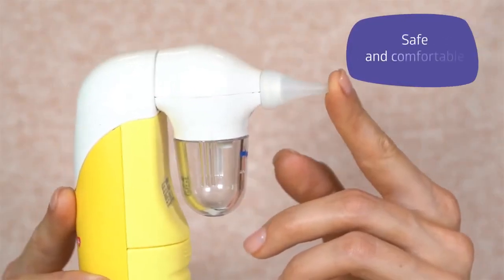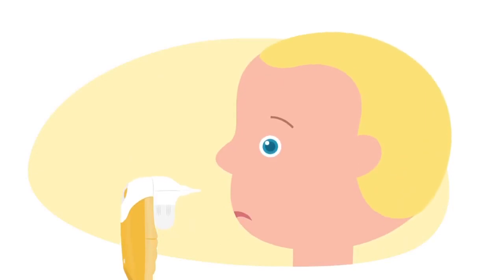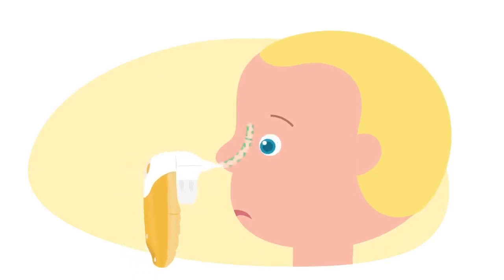The soft silicone material rules out injuries. Just press and hold the button to clear the nose. The procedure is completely under your control.